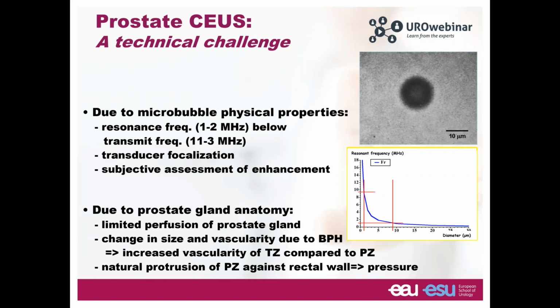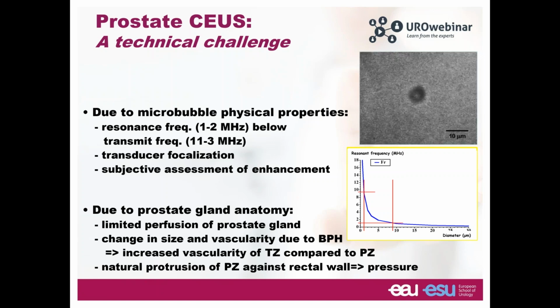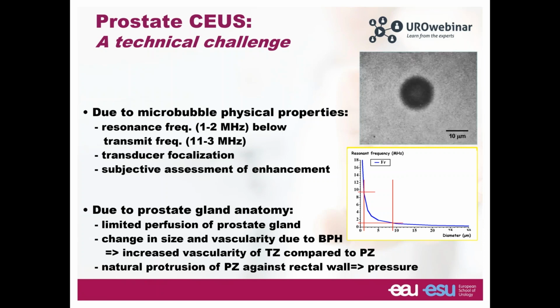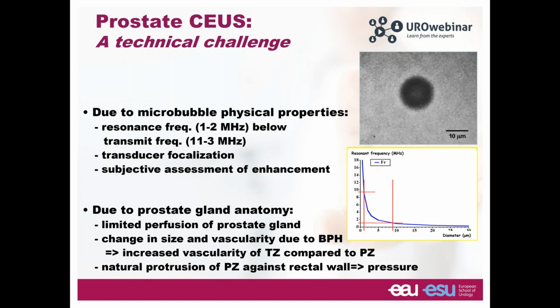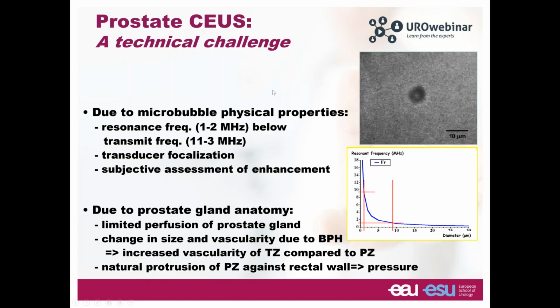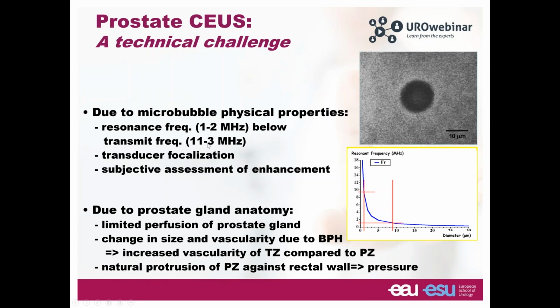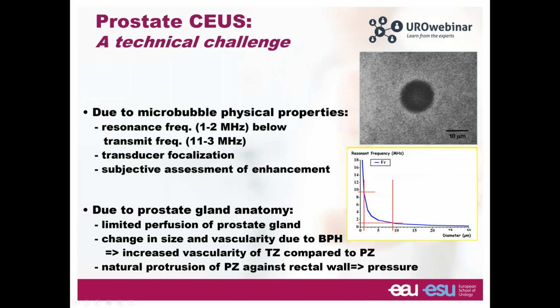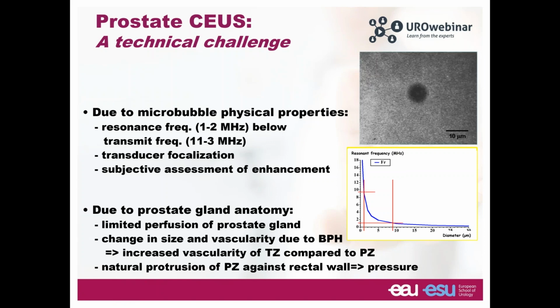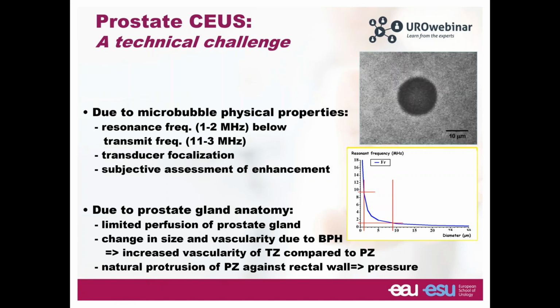However, prostate contrast enhanced ultrasound is a technical challenge because the frequency that is used for prostate imaging with the ultrasound is quite far. The frequency is much higher than the resonant frequency of the bubbles. There are issues dealing with the transducer focalization and of course from the subjective assessment of the enhancement.